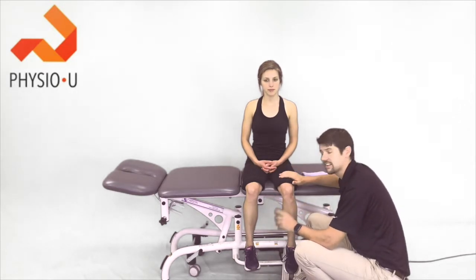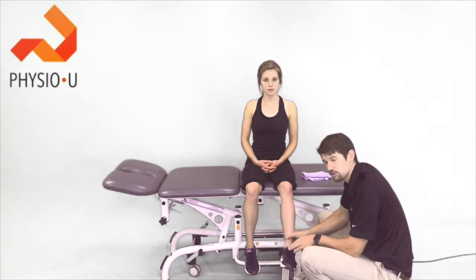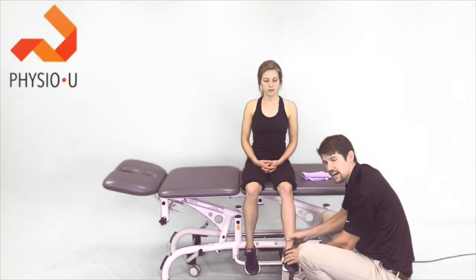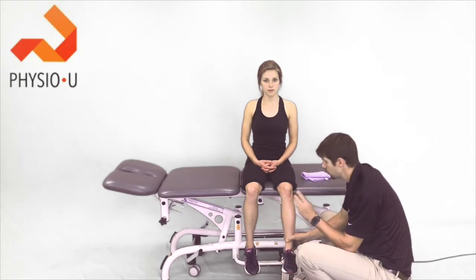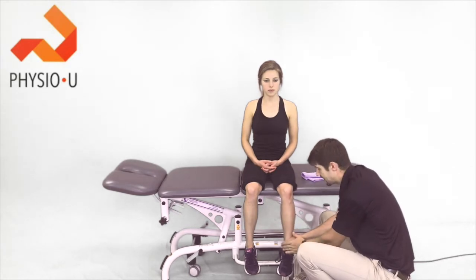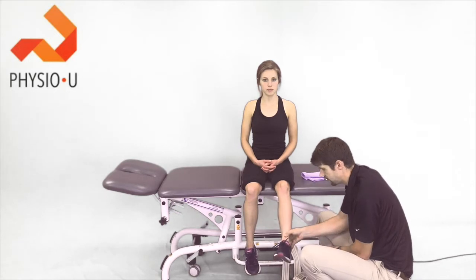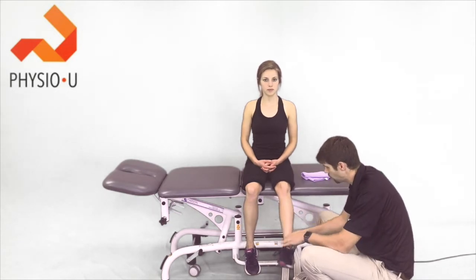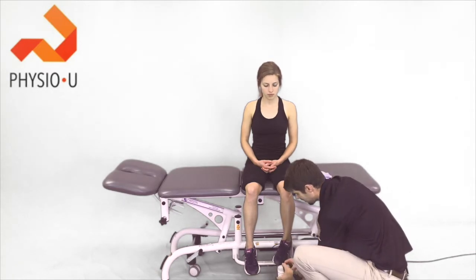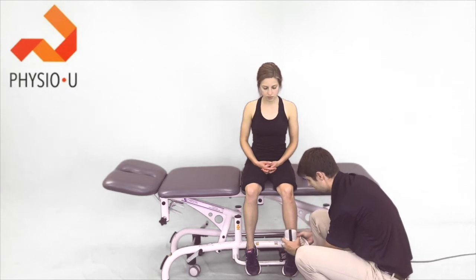The first was a one rep max on the leg press. The second was a one rep max with a knee extension machine, commonly found in the clinic or gym, going from 90 to 45 degrees. The third was a one rep max on the knee extension machine from 90 to zero degrees of flexion. The last option, which I'm going to show you here, uses an electronic handheld dynamometer.